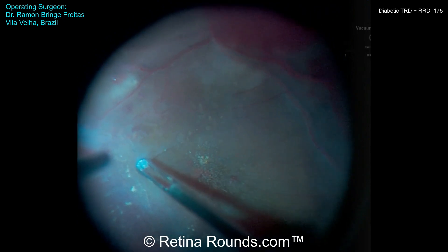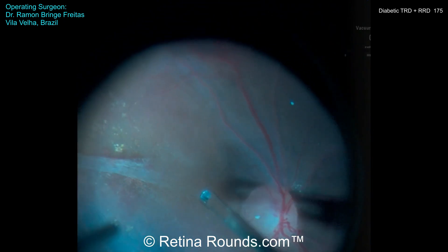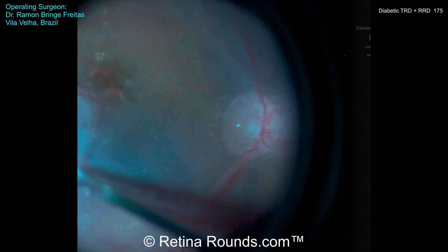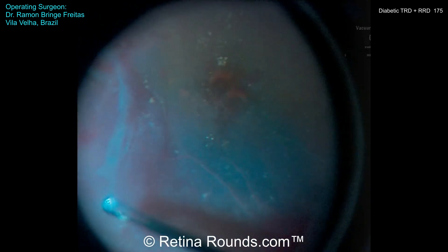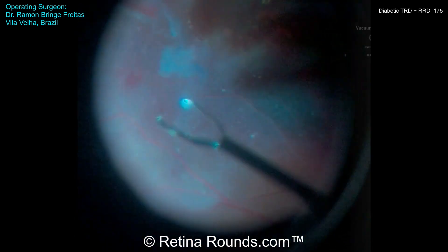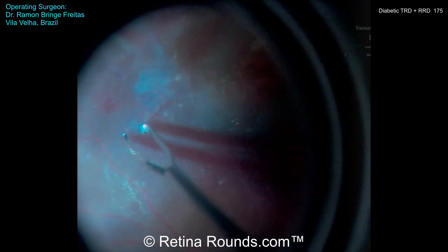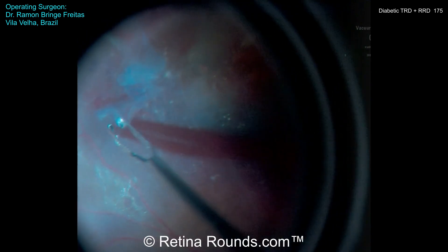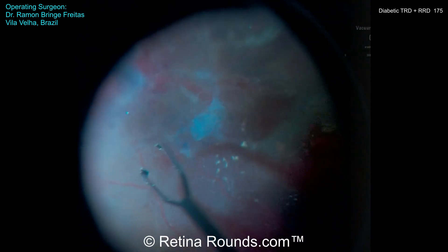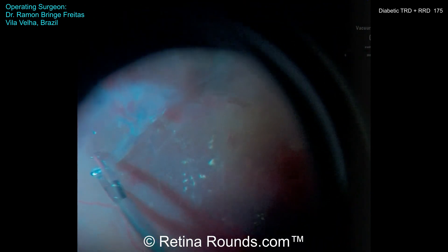He can now visualize a membrane over the macula. This is very nicely elevating over the macula — this is not an epiretinal membrane, but in fact the posterior cortical vitreous. This is a very important and critical step to elevate the vitreous here over the macula. He's now propagating that vitreous detachment using the forceps in a more temporal location to try to propagate the PVD temporally, where the retina is more bullously detached and those peripheral retinal breaks are present.